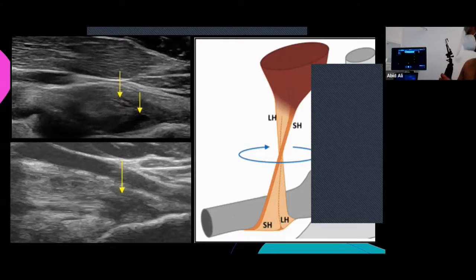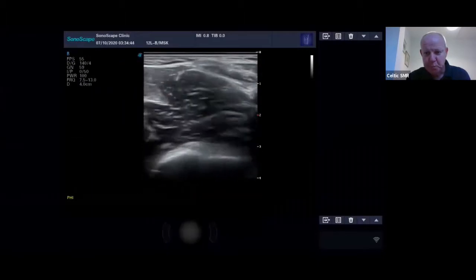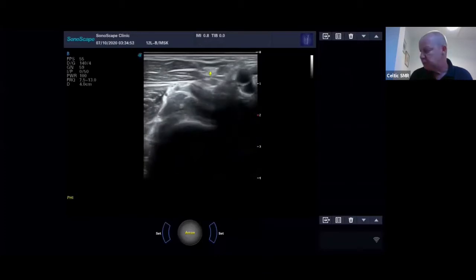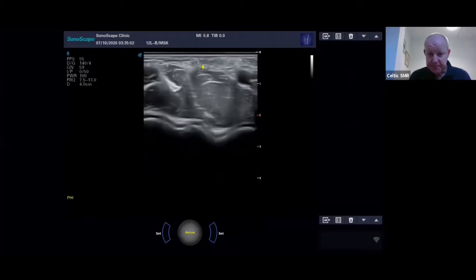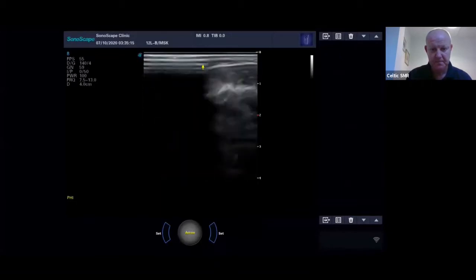Now there's another bit of anatomy that comes off the biceps tendon, and that's the lacertus fibrosus. You can pick that up on ultrasound. I'll have a look, see if I can find it, but let me just switch back to the screen. So it shoots off medially. So this may be it coming up here. Now if the distal biceps is ruptured, you'll probably get more of a retraction. But if you're down at the distal biceps and there's not much retraction from a rupture, then there's a good chance that the lacertus fibrosus is still intact.